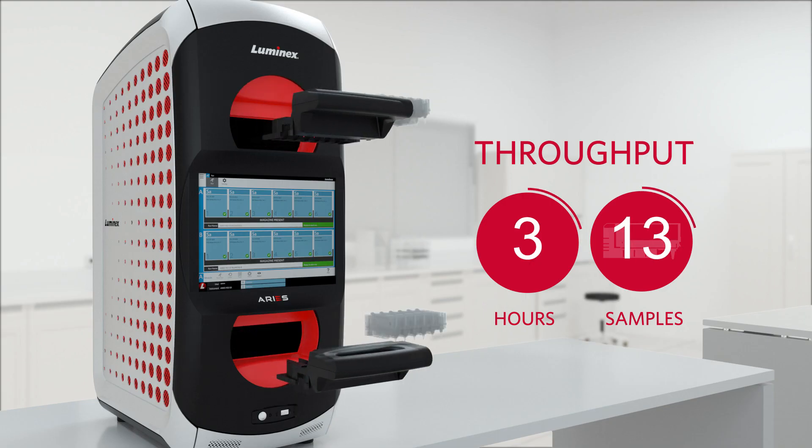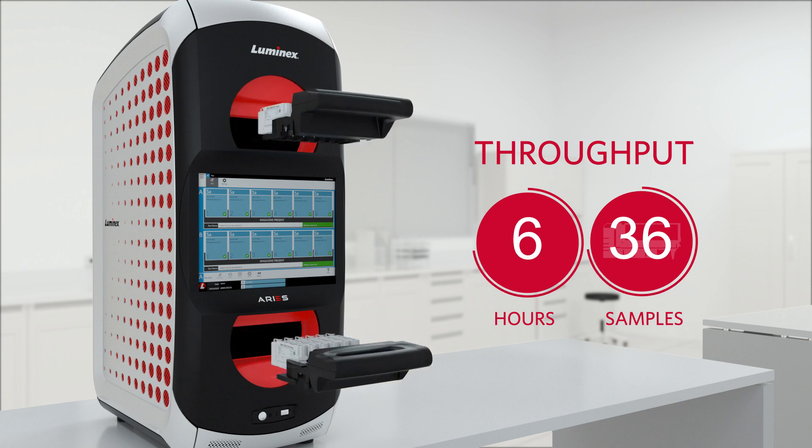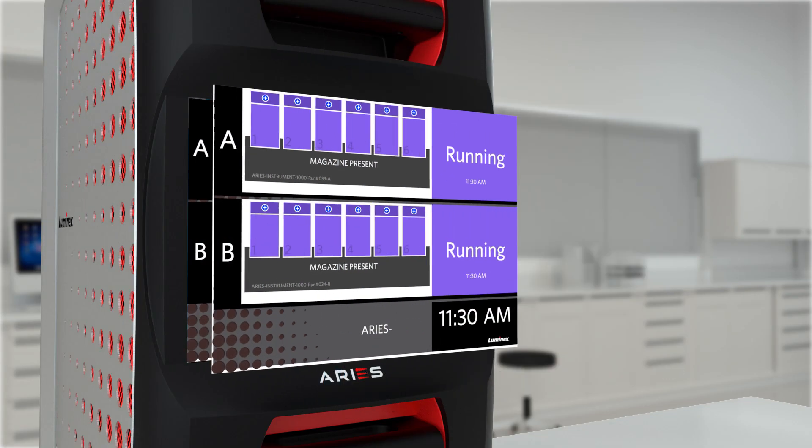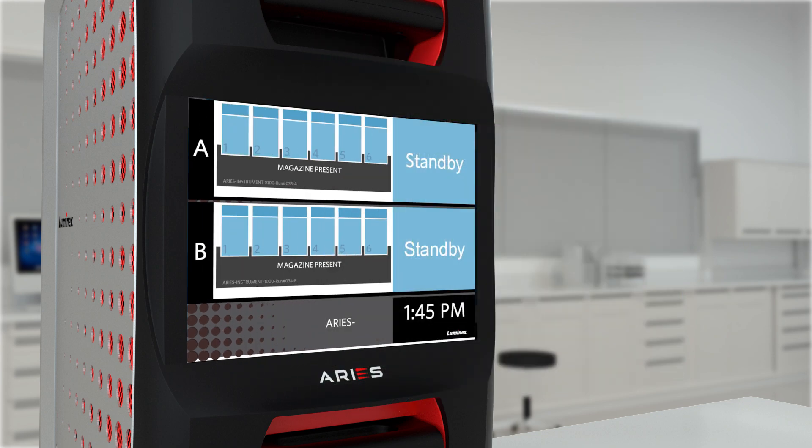The time to result is two hours for up to 12 samples. Up to 48 samples can be run on a single instrument in an eight-hour shift. Test reports can be viewed on the ARIES touchscreen or they can be sent to the LIS and printer.